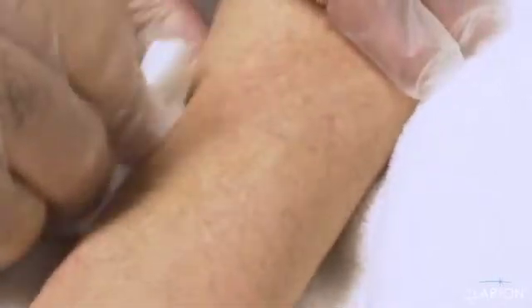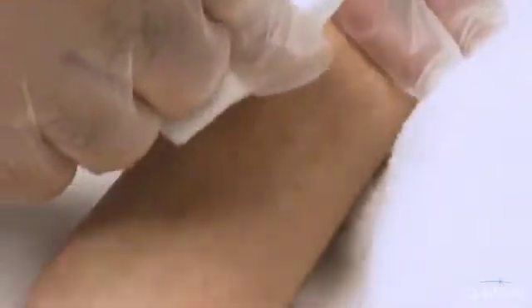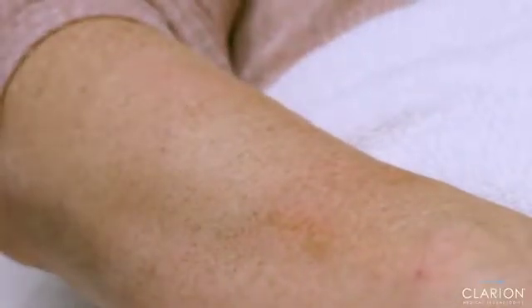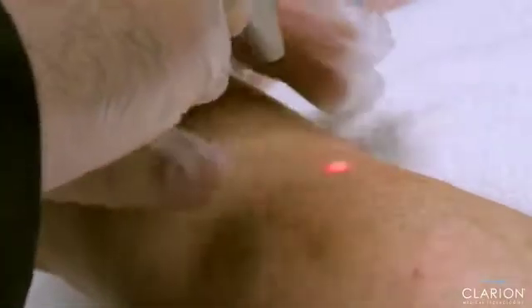So this was one pass, and we might need to do 2 or 3 passes in order to get good improvement of the pigment. But we can see already some change with the first pass. So we make sure that we remove the tissue debris. We can see that the area improved. And then now we are going to start with the second pass.